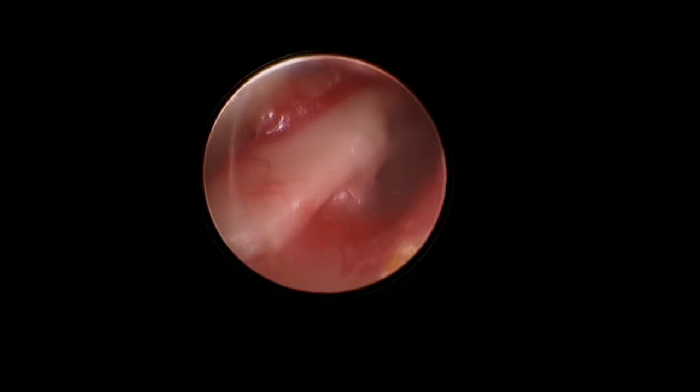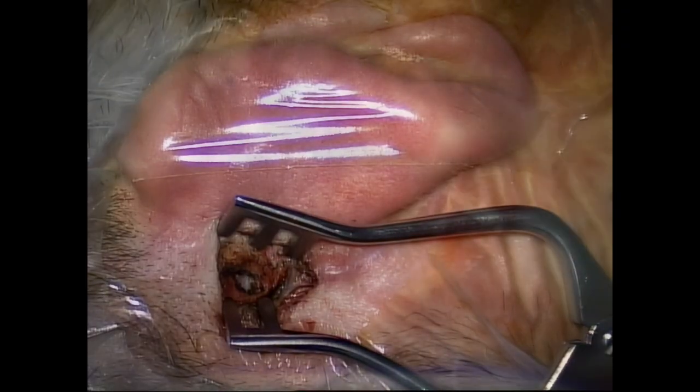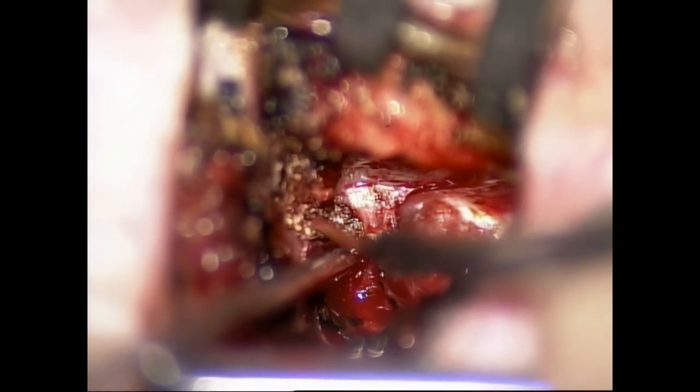Now here's another film in a patient that had a more extensive cholesteatoma. You can see this is the view with an endoscope through the external auditory canal. Required a much more complex reconstruction without any normal or reasonable residual tympanic membrane. The tympanic membrane reconstruction is intact, and this patient, due to the extensive disease, has a lot more fibrous tissue in the middle ear because there was a lack of considerably normal mucosa in the middle ear.